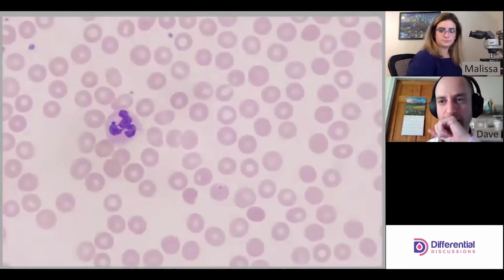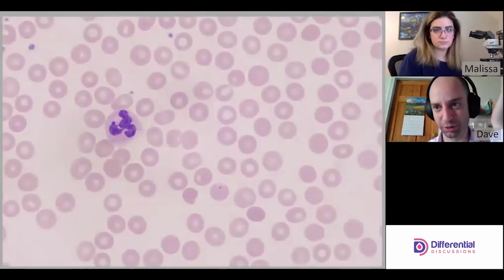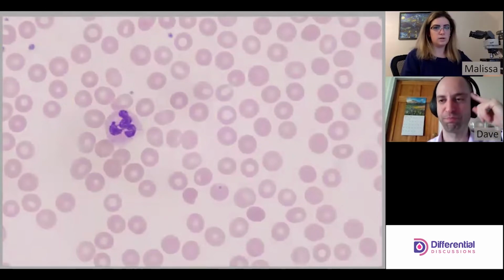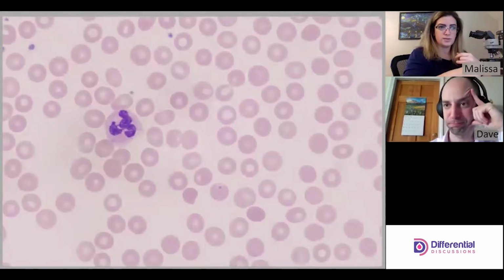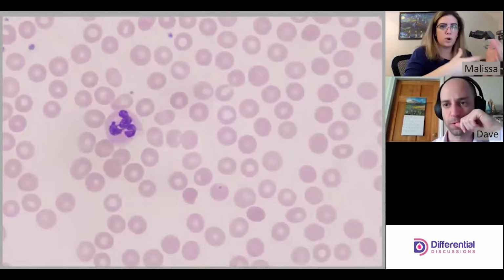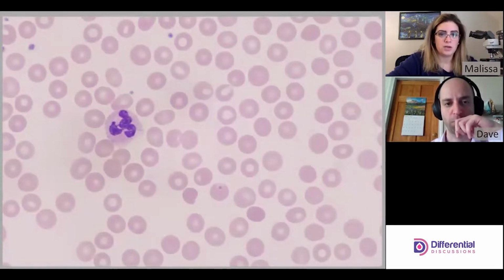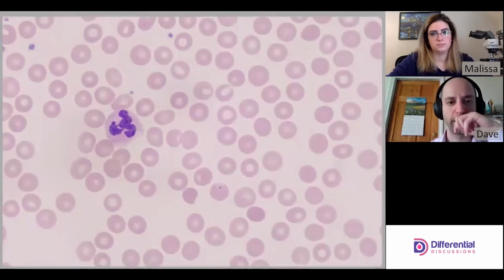Beautiful. So this is the most common cell to encounter, the neutrophil. Describing the cell, it's got pinpoint granules. They look more pinkish in color, although we know neutrophils have pink, light blue, and purplish granules, and generally we see more of the pink. So we have pinpoint granules throughout the cytoplasm, and a normal neutrophil will have 3 to 5 lobes.